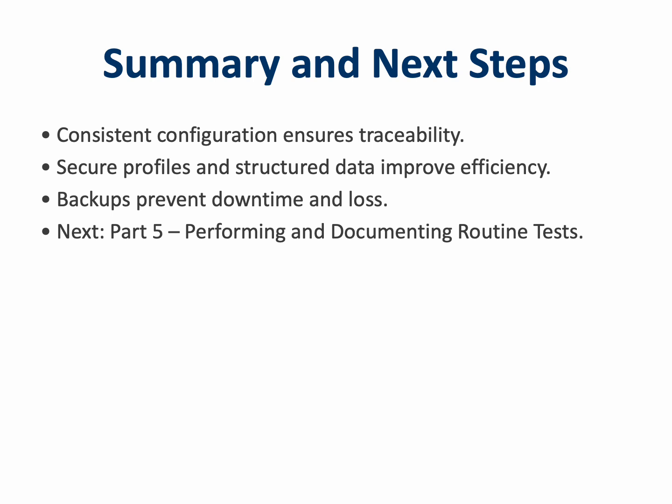In Part 5, we'll move into the operational side: how to perform and document routine electrical safety tests effectively using the Rigel 288 Plus. Think of today's configuration work as the groundwork that ensures every future test is accurate, compliant, and confidently executed.